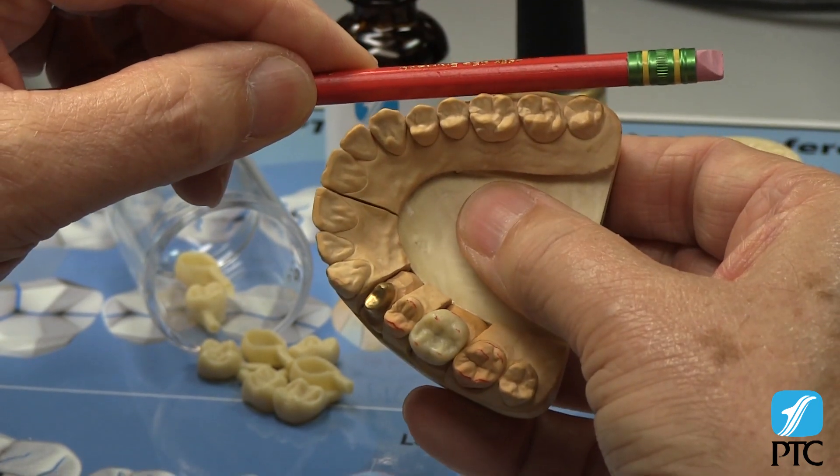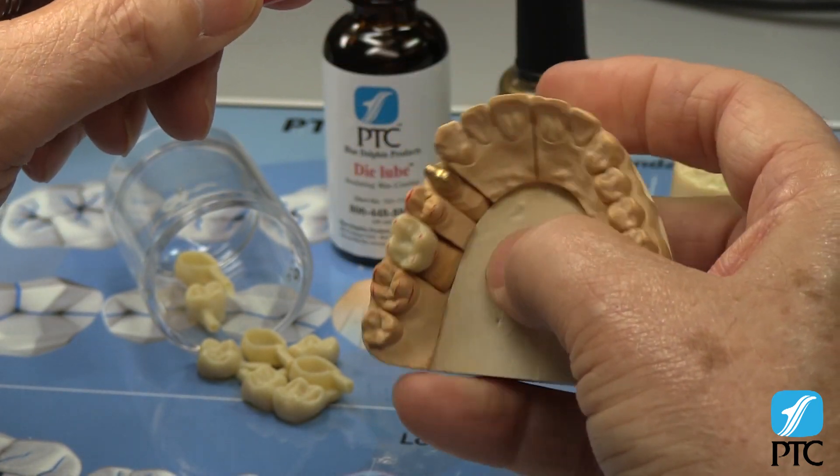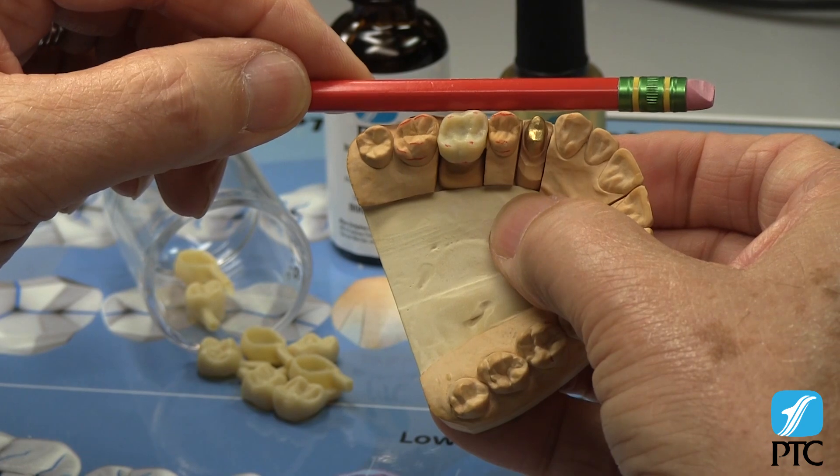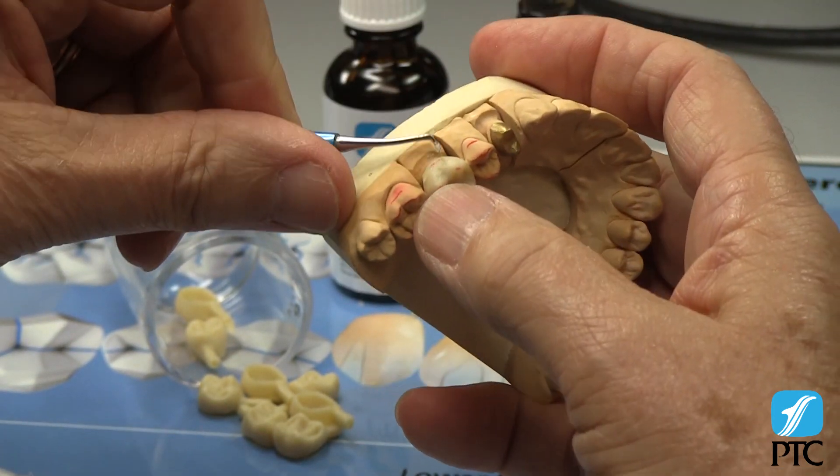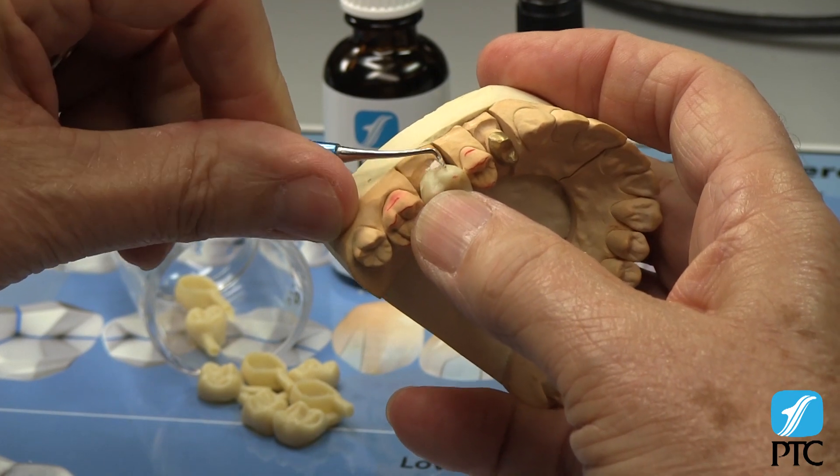First, reduce the buccal and lingual heights of contour. Then measure with a straight edge to get visual confirmation that you have reduced the correct amount.